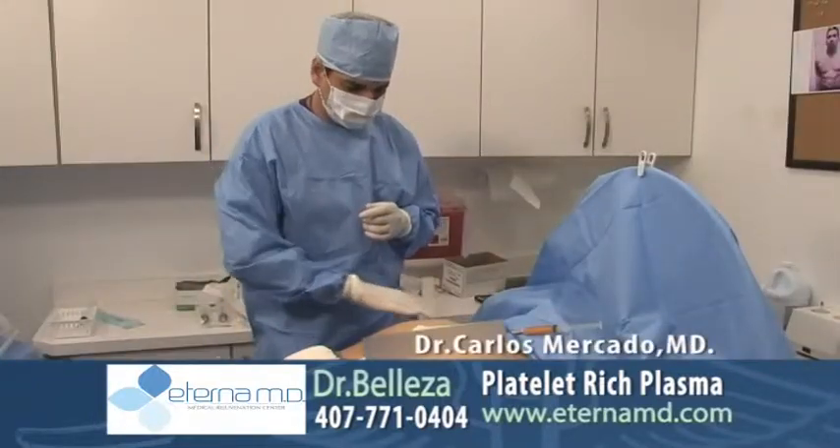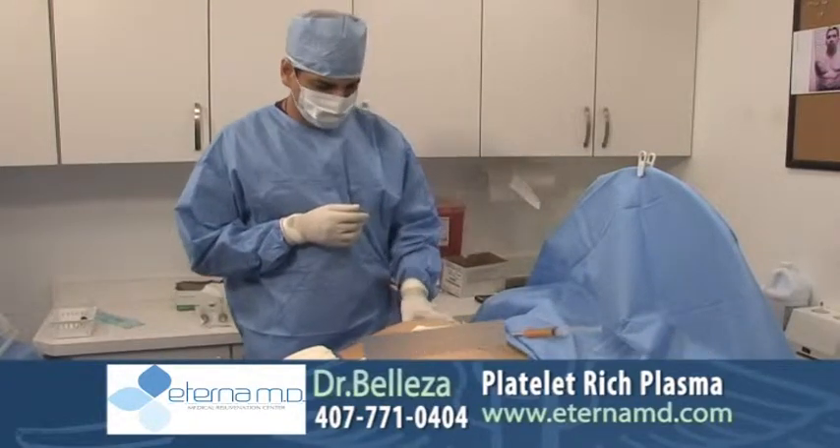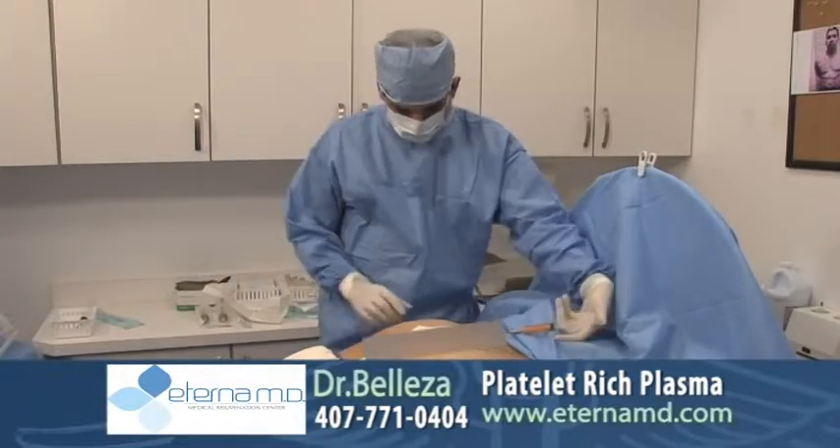In this procedure here you can see that we are inserting the fat that we collected back into the glutes. Right here we're trying to enhance the volume, make it look more masculine, and build a better physique.